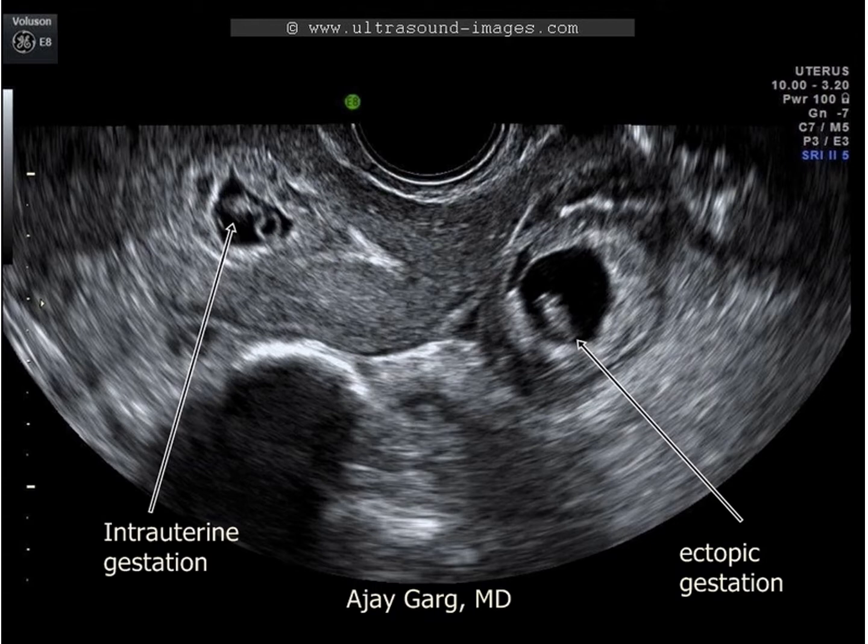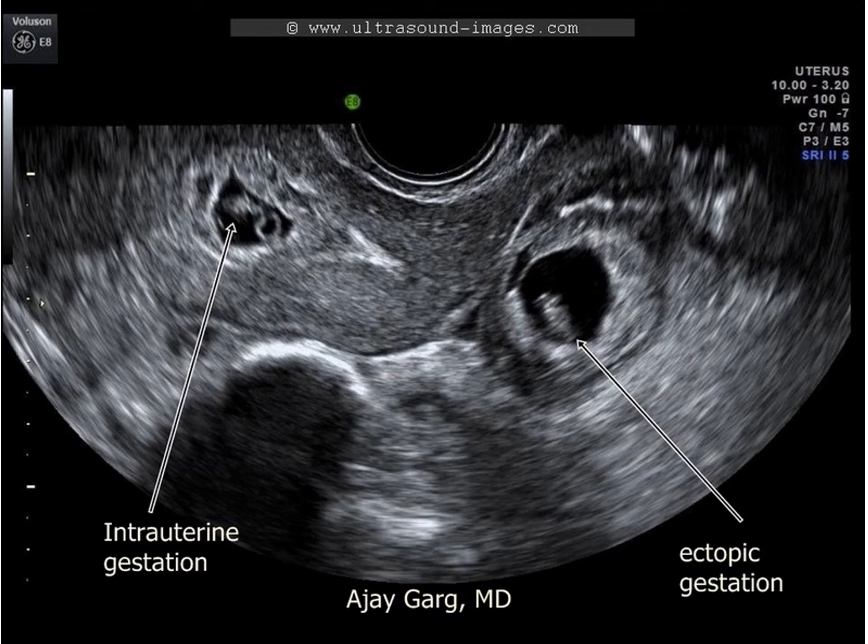Extrauterine pregnancies, also known as ectopic pregnancies, are located outside the uterus. On ultrasound, an ectopic pregnancy appears separate from the uterus and doesn't have a thick muscular organ around it, likely situated in the fallopian tube. The diagnosis is clinched if we can see an embryo with a heartbeat. You would also look to see if you can identify the ovary separately from the ectopic gestation.